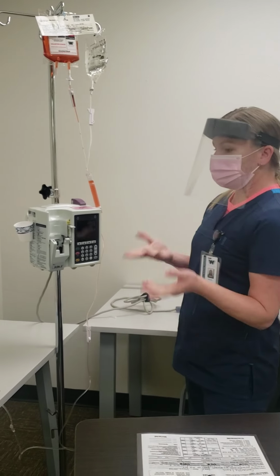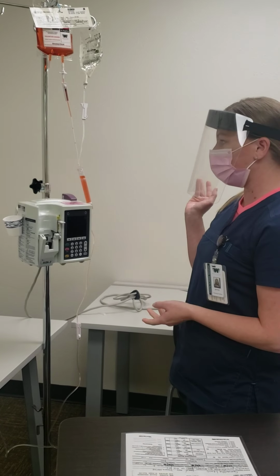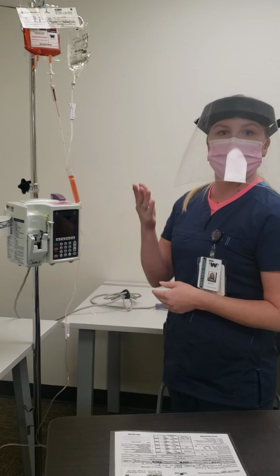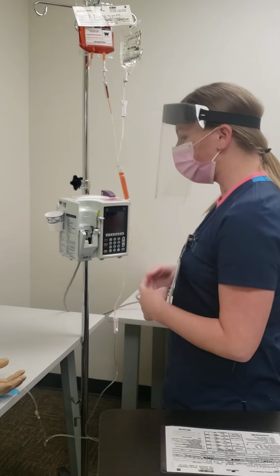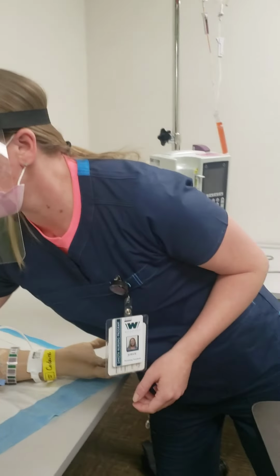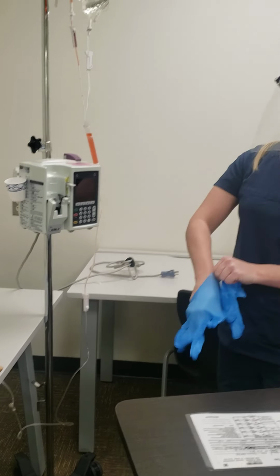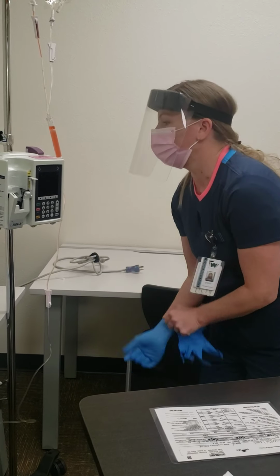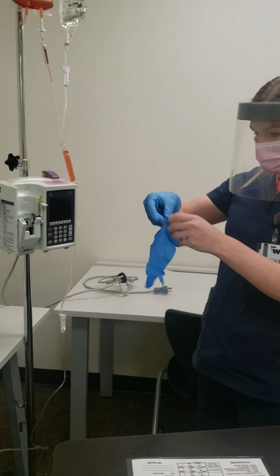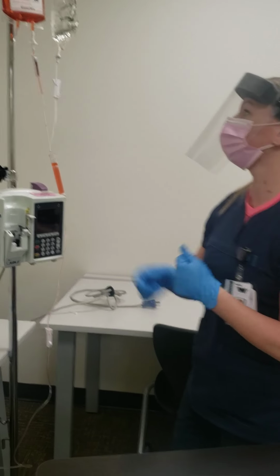And once I realize that she's not having any adverse reactions, I can go ahead and up that drip to get the blood in. And then, so now she's finished. And I'm going to go ahead and do a third set of vitals. And then I'm going to go ahead and discontinue this infusion.